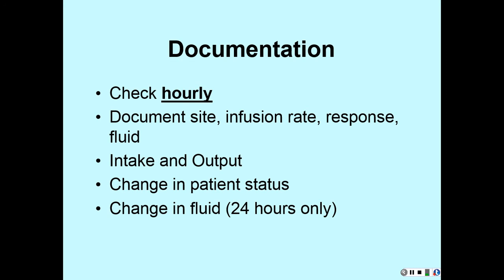She said if it takes a while from the time that she counted it to the time the patient got to you, and you can count 300, but by the time the patient got to you, it's 250, you still count it from 300 because that's when she did her intake. What I would be concerned with is how fast that IV is flowing.